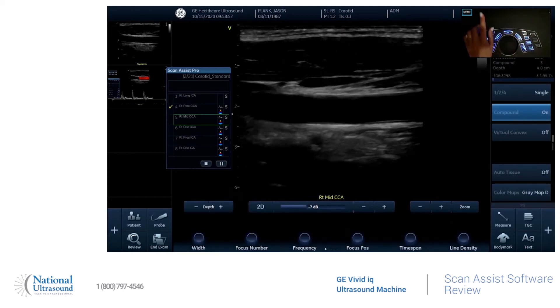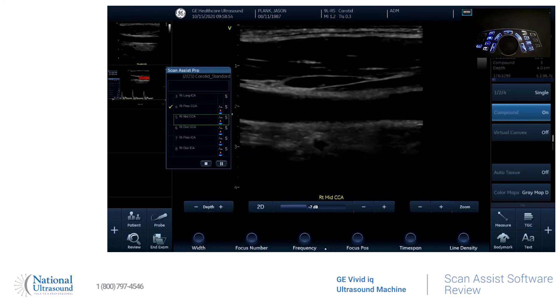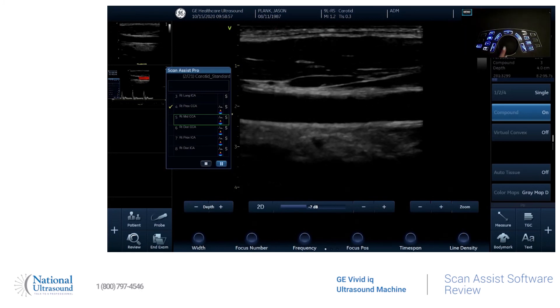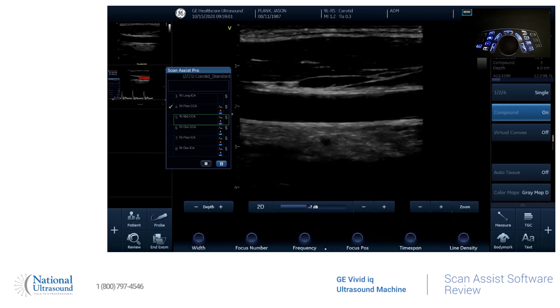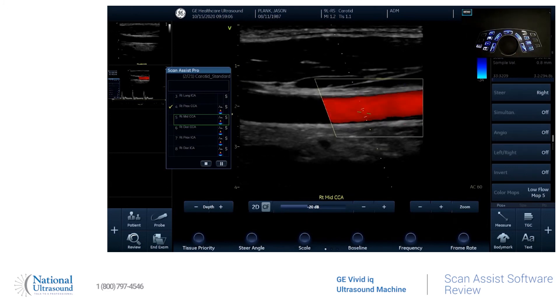If you want to get off the ScanAssist at any point to take extra images, just hit pause — it's going to take the writing off the screen and you can take as many images as you'd like. When you're ready to resume, just hit that button and it'll go back to the step you were on.